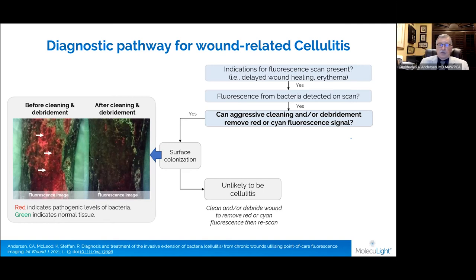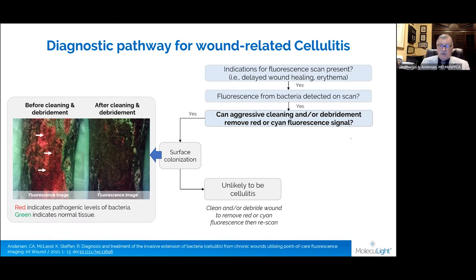You can see an image here with a lot of fluorescence. However, after thorough cleansing, the fluorescence was removed. So this is surface colonization — this is not cellulitis. This is something we would not treat as cellulitis and would just proceed with our standard of care.